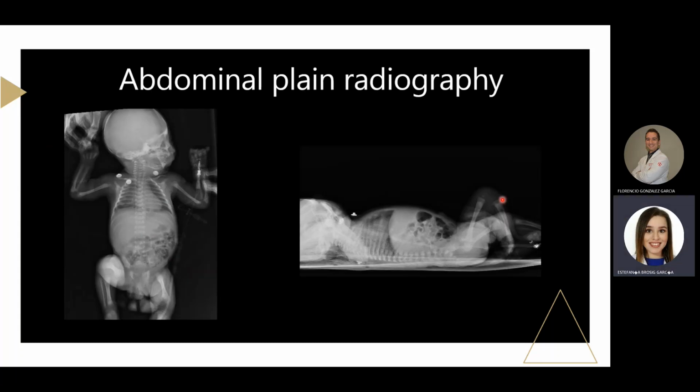We have two more abdominal radiographies obtained with a vertical and a horizontal beam that show an absence of the dilatation of the intestinal loops, the intramural, and the portal venous gas seen in previous imaging studies. So the patient presents a clinical and radiological improvement.